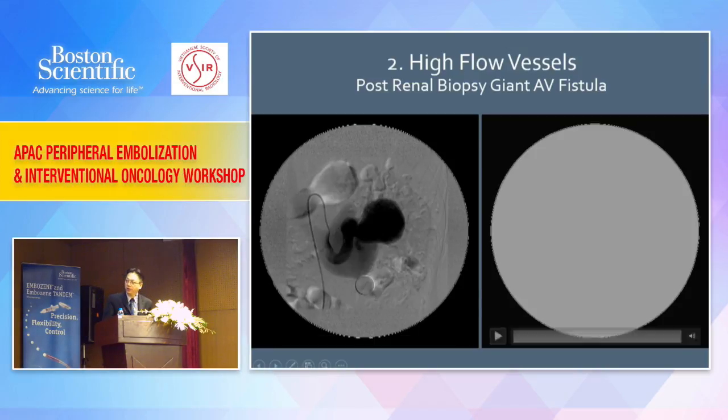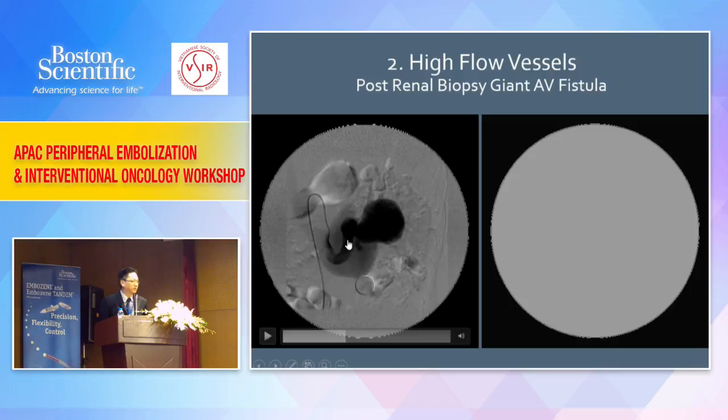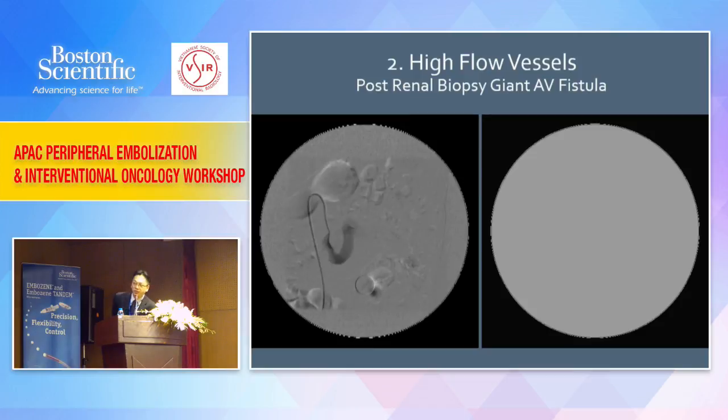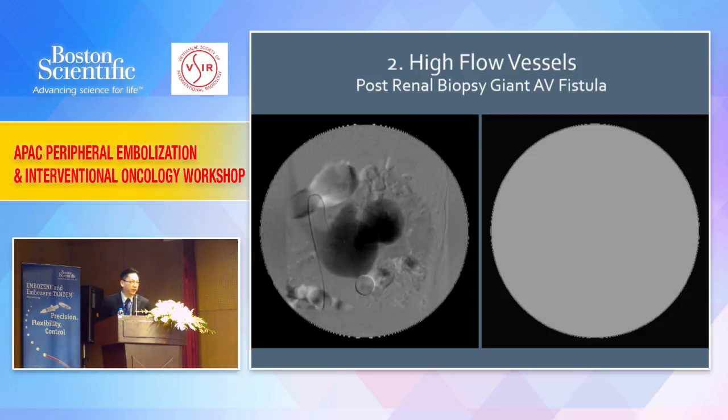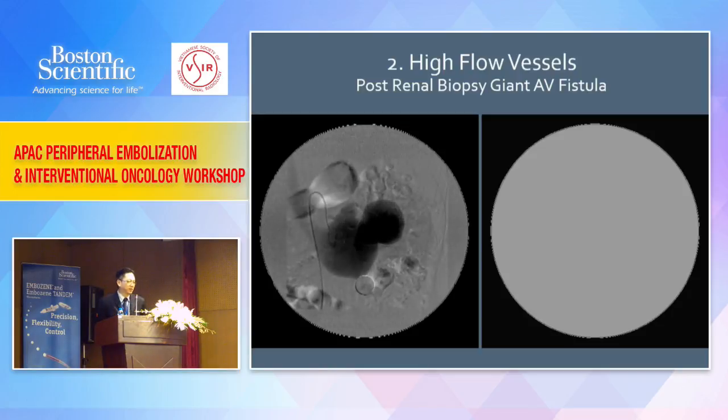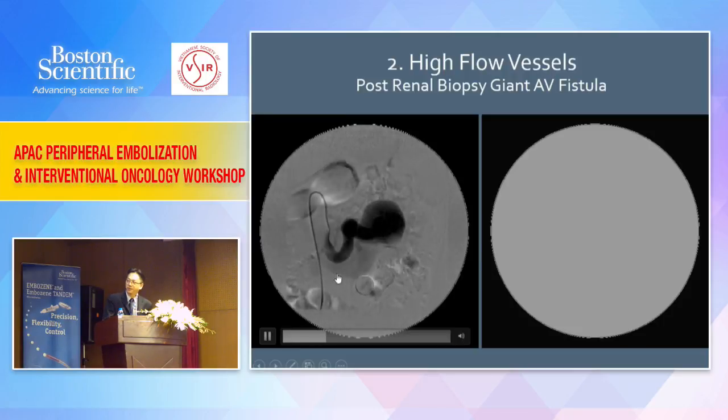More selective. You put your catheter until here. Can you show the run again? And this is at 15 frames per second. You see that the renal cortex is not outlined at all. Quite like the second patient I showed. If you occlude the outflow, will that help? Your outflow is easily 5-6 cm, the outflow on the venous side.